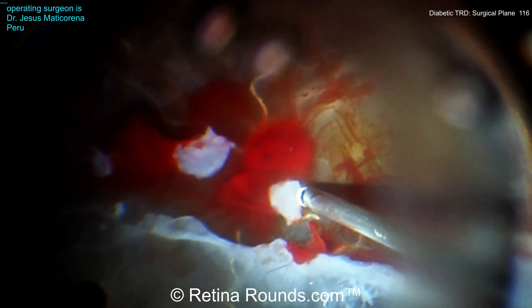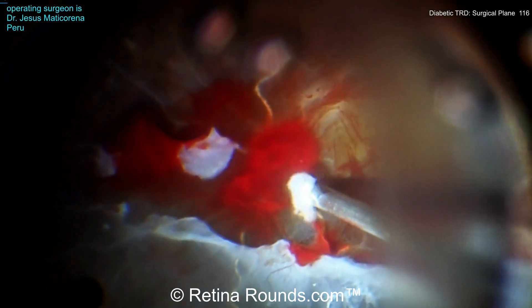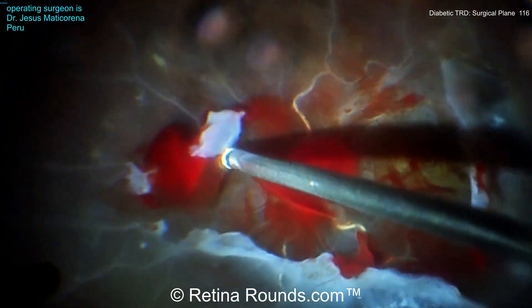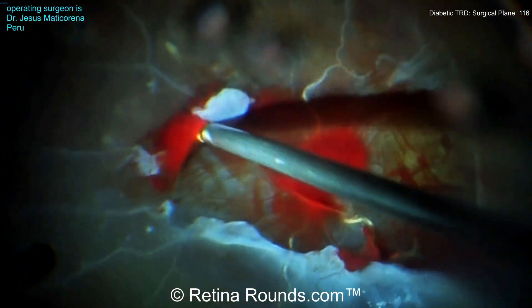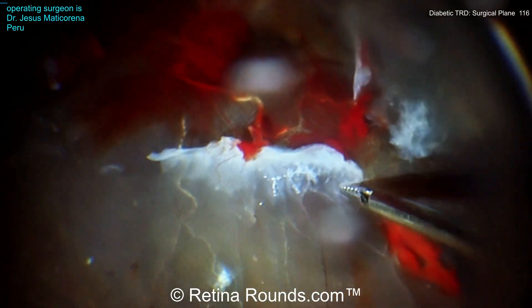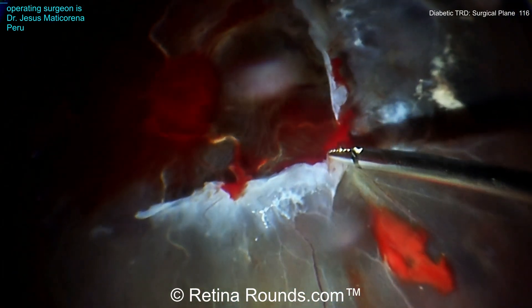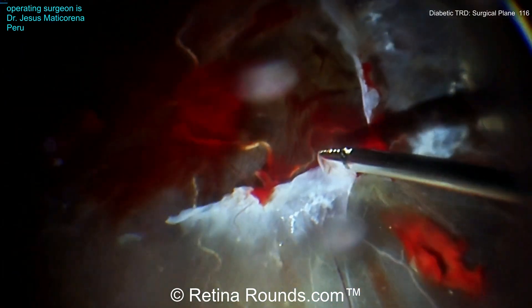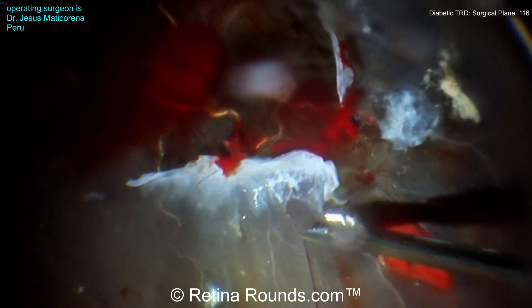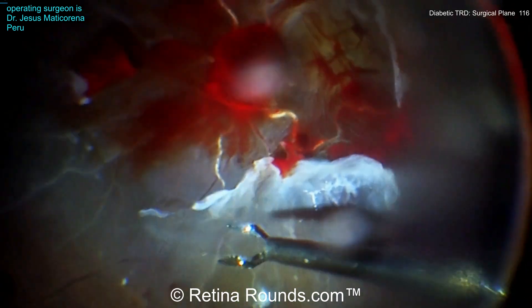There's quite a bit of bleeding going on here, and that's important to try to address. Diabetic blood can be very rich in fibrin and therefore very highly adherent to the underlying retina. If left behind, it can actually create another surgical challenge of trying to elevate the hemorrhage off of the retinal surface.